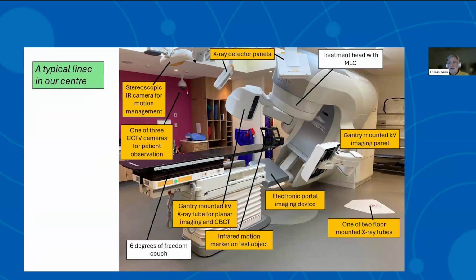It is also relevant to highlight that modern radiotherapy equipment is virtually only defined by its imaging modalities. The linear accelerators, which deliver X-rays between 4 and 18 or 20 MeV, are always virtually identical. What distinguishes linear accelerators and therapy equipment is all the imaging kit.